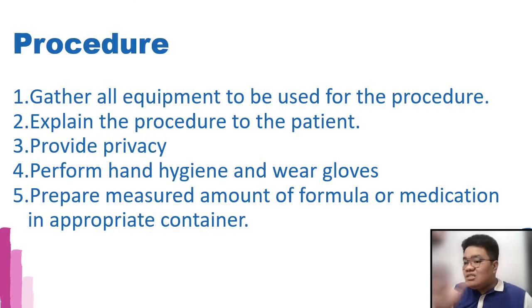Now, class, this is the procedure. So, of course, we gather all the equipment to be used for the procedure. You explain the procedure to the patient. So, in your return demonstrations, if ever you will be doing demonstrations on this, do not just narrate. Okay, instead you will say, I am gathering all the equipment to be used for my procedure.